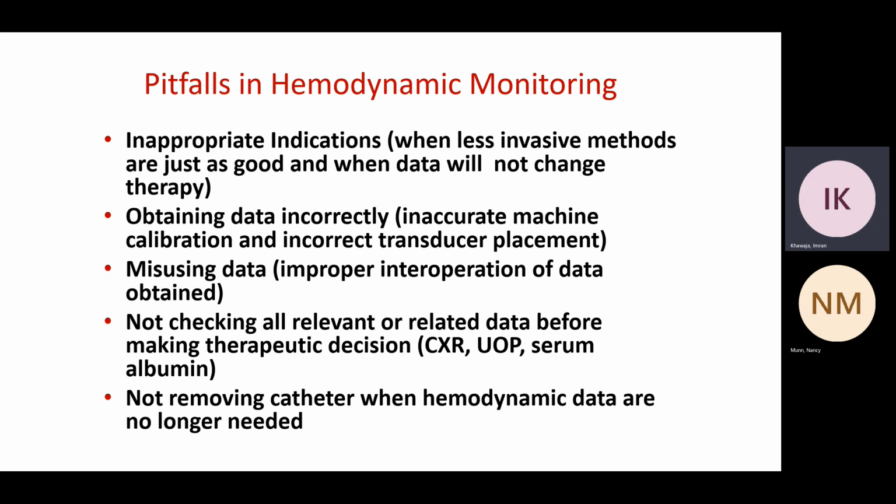Always make sure the numbers add up and make clinical sense. They should correlate with what you see with your eyes on your patient's exam, their x-ray, their labs, and others.